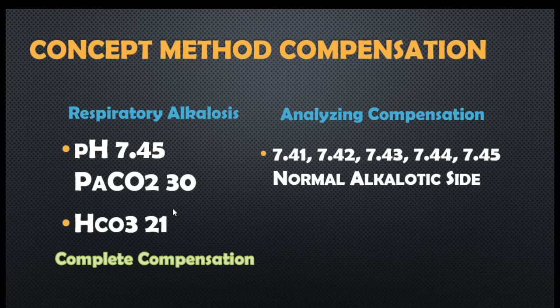It is leaning more onto the alkalotic side. The right analysis of this one is respiratory alkalosis, and it is compensated by your bicarbonate decreasing in order to counteract the alkalinity of the blood and bring the pH level back into the normal range.